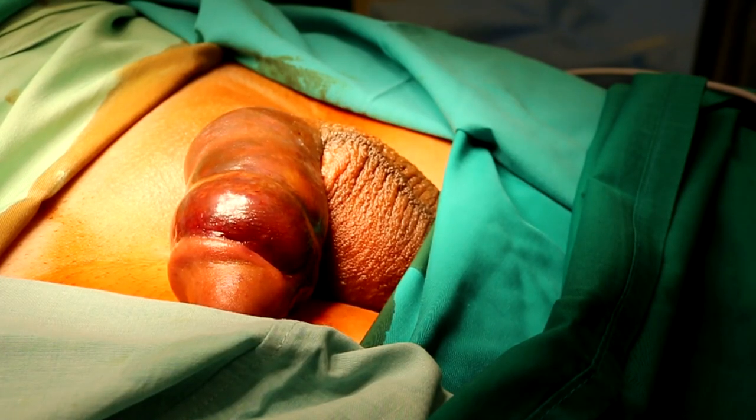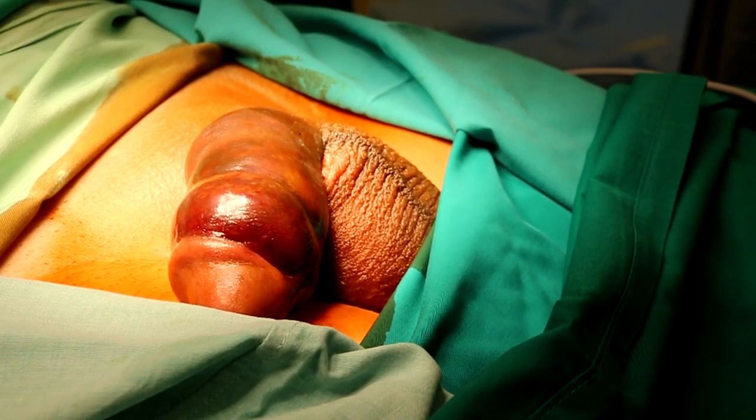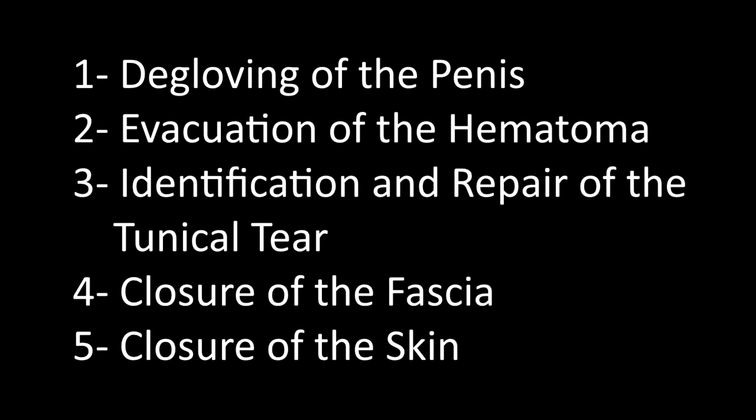Okay, and the patient has to be taken to the OT, and here is the patient in the operating theater. So there are five basic steps in repair of fractured penis: degloving of the penis, evacuation of the hematoma, identification and repair of the tunical tear, and then finally closure of the fascia and the skin. Let's start first with the degloving of the penis.